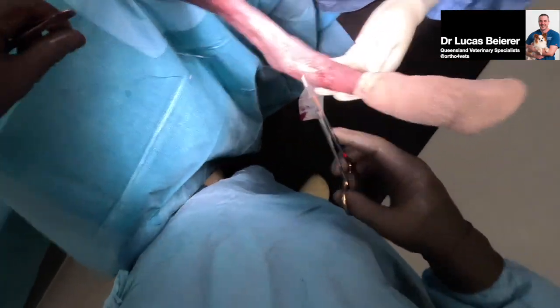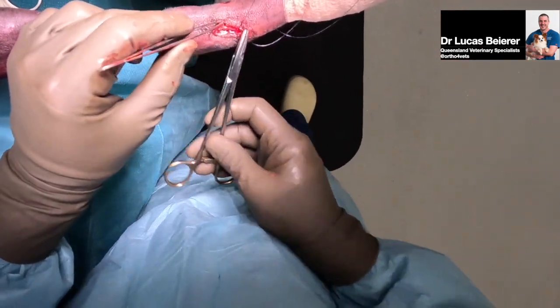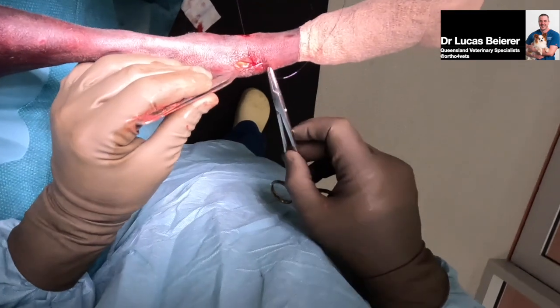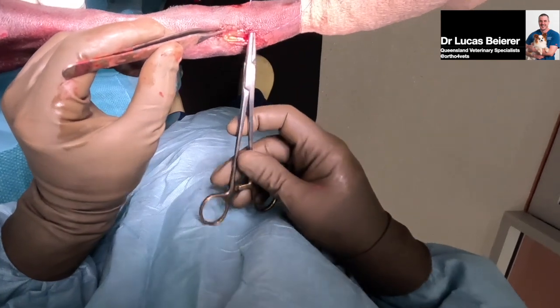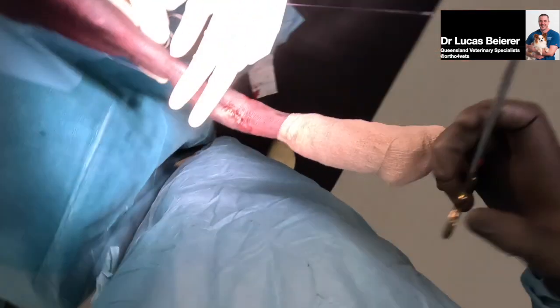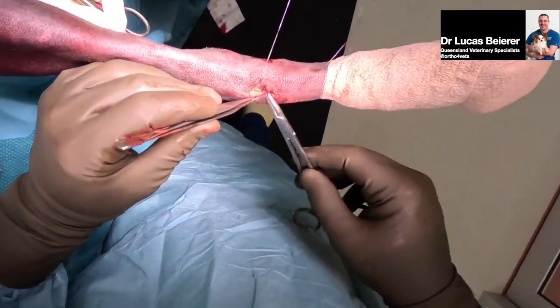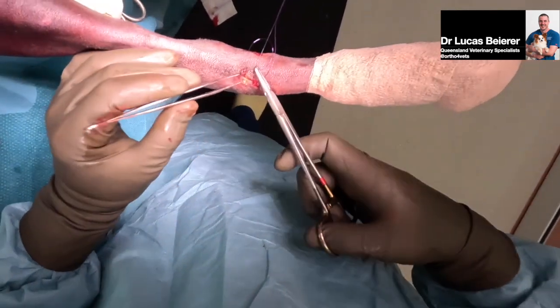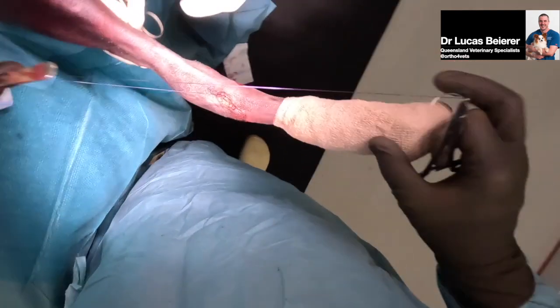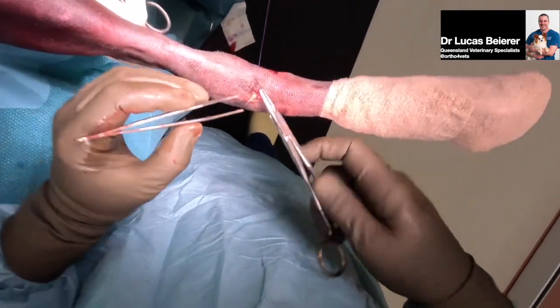So we're just going to close this now so that we don't have to battle two closures and the tension associated with that. I think this is one of the greatest challenges of this whole journey, is managing the soft tissue tension, and a releasing incision's not uncommon. It just brings with it a whole bunch of logistical effort in terms of coordinating the owners, and although it's not relevant in this case, the typical greyhound trainers have a lot of commitments for those dogs, and it's difficult to always get them to return for appointments.